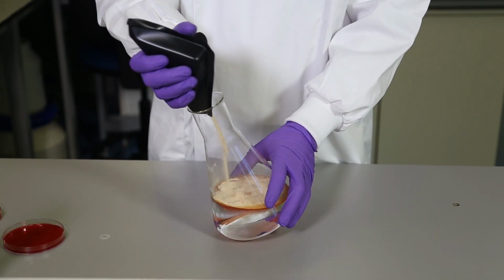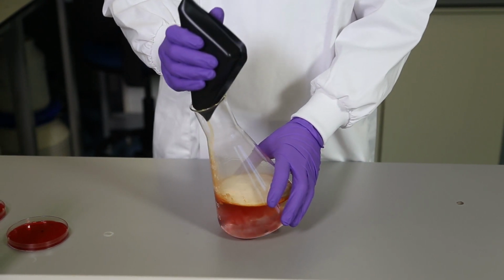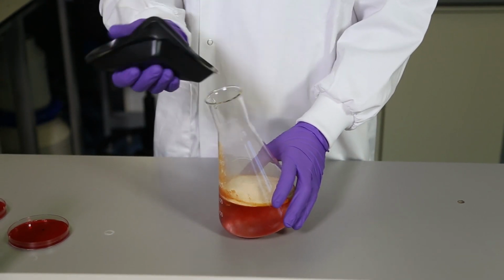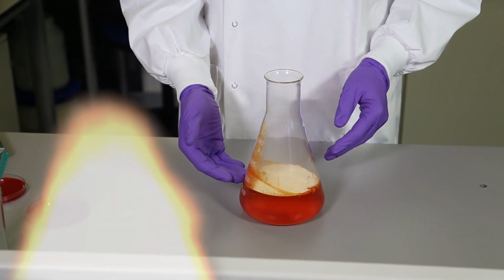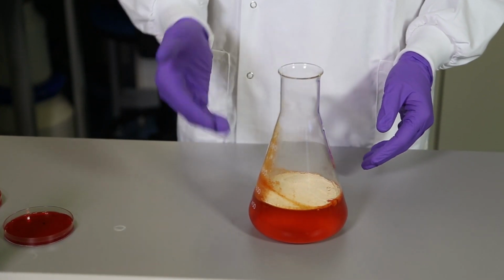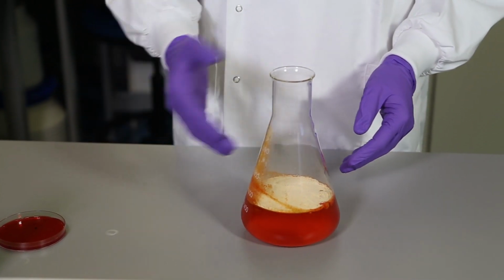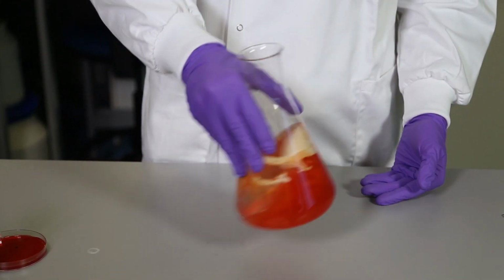Here, I have added the powder to the water. And as you can see, it sits on top of the water before slowly dissolving. If heat is applied now, before all powder is dissolved, parts of the powder may burn and form the precipitate you saw earlier. To prevent this from happening, powder should be fully solubilized before heating.